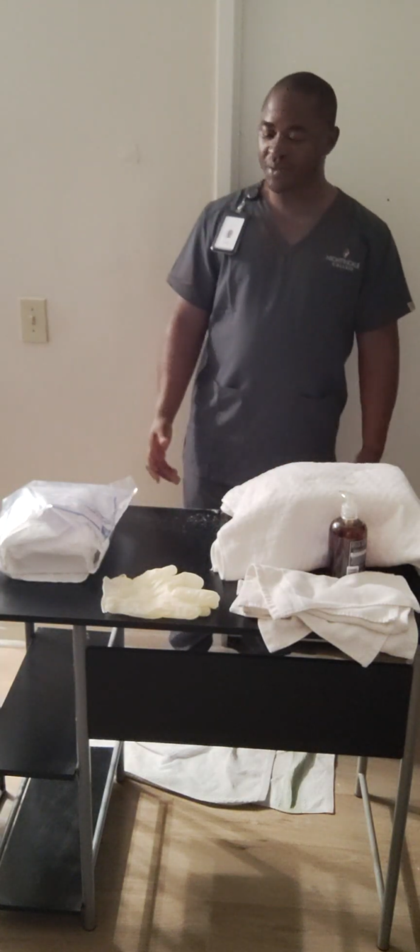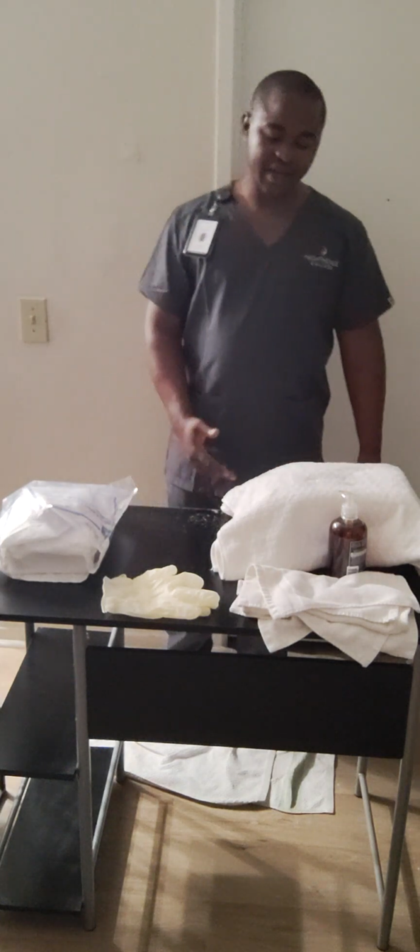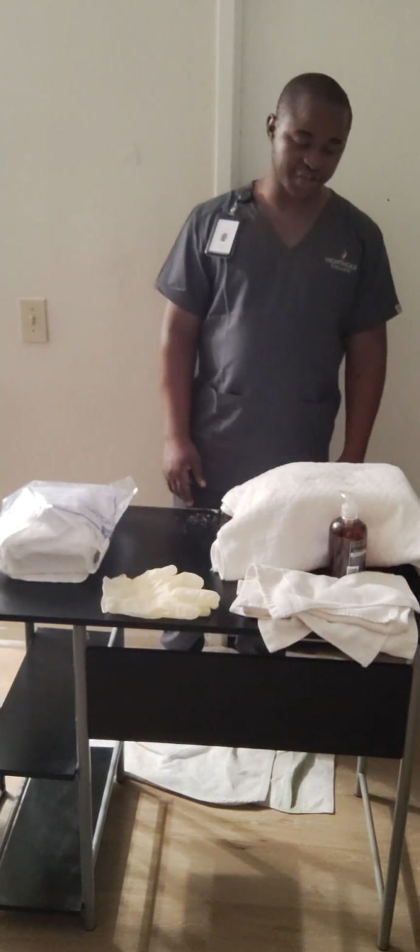After I do that, I'm going to position the bed into a nice working position, and I'm going to reposition my patient into a nice dorsal position. I go ahead and put on my gloves.